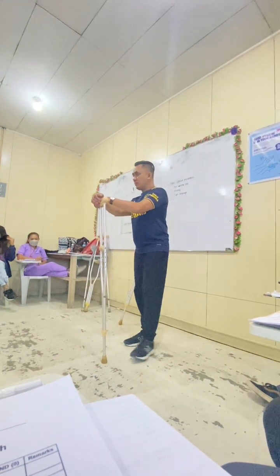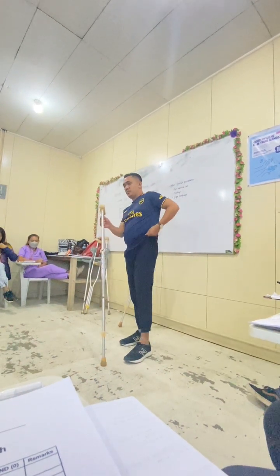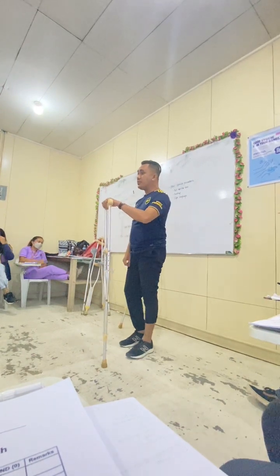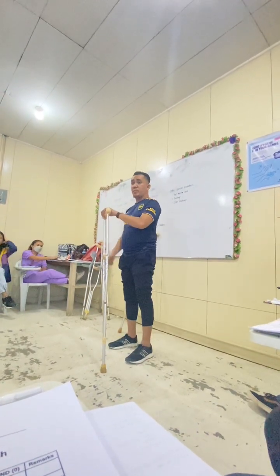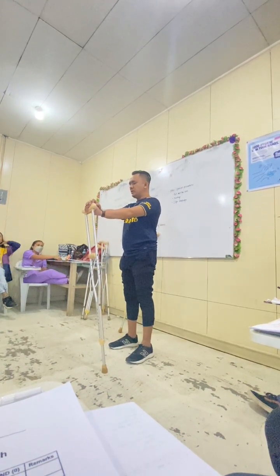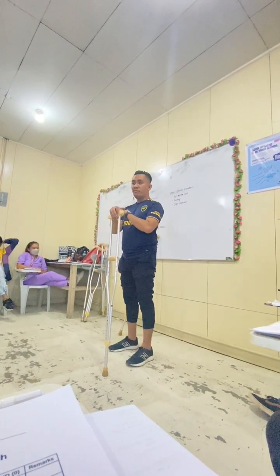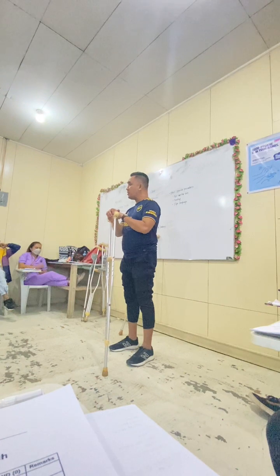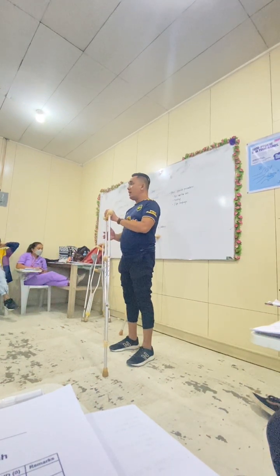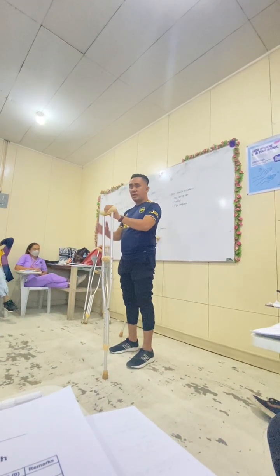If the patient is unable to stand, simply subtract 16 inches from the height to determine the crutch length you need. So ask if the patient can stand straight, much better guys, because it's easy for you to fit the crutches. But if ever the patient cannot stand straight, nakahigda pa lang siya, i-prepare na ninyo daan ang height, by asking your patient, pila yung height, then subtract it.